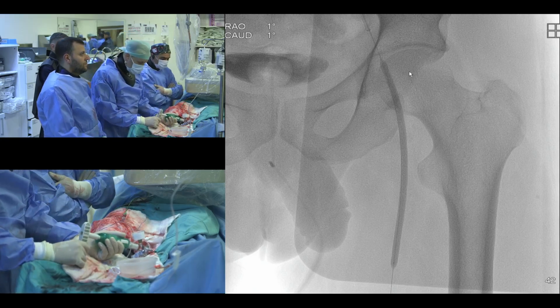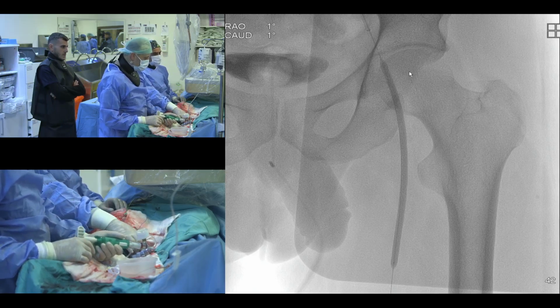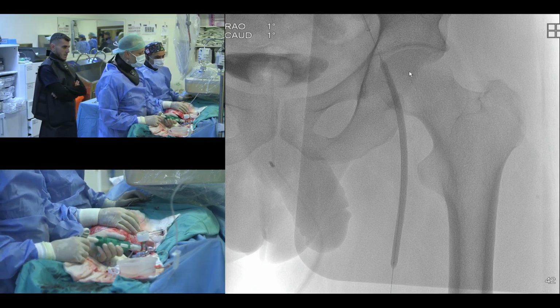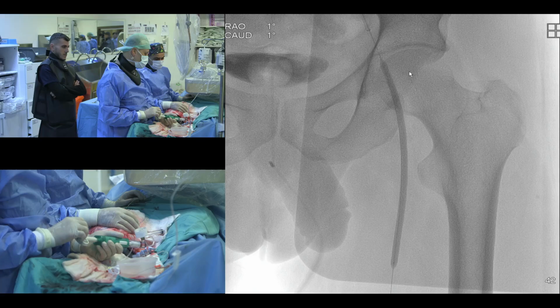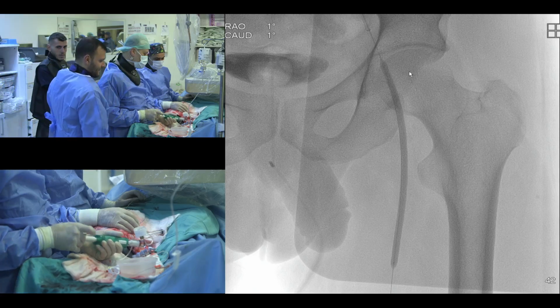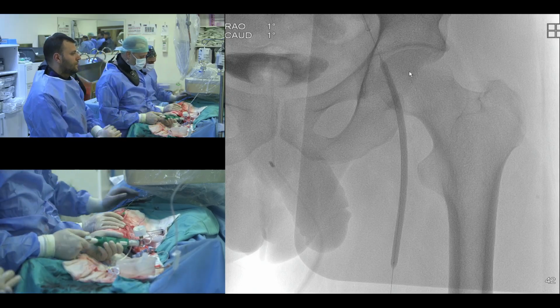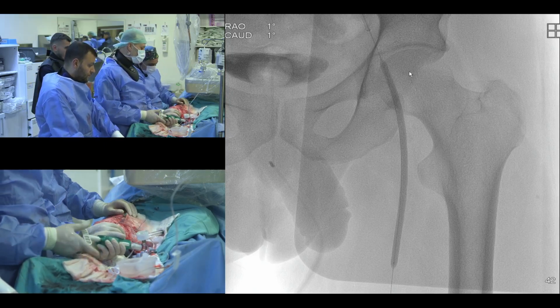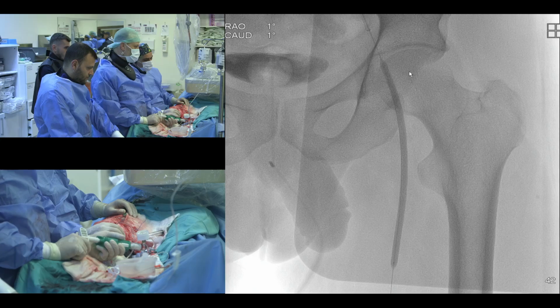There is a visualization of the anterior tibial artery, and maybe if the pedal access is a problem, the anterior tibial artery may give a mark, and the bidirectional approach will be, I think, more useful for this case, because the popliteal artery is completely diseased, and also the trifurcation is not so good. We don't know the distal landing zone. That is our major problem. We don't have a distal landing zone and distal puncture sites.